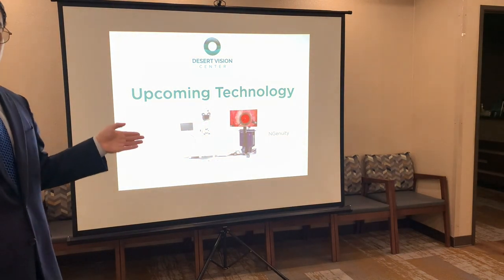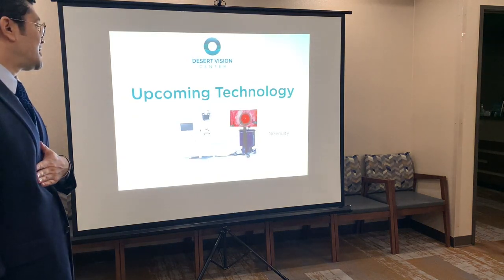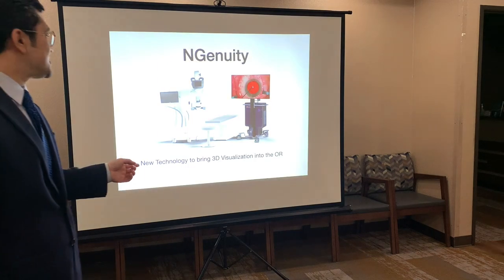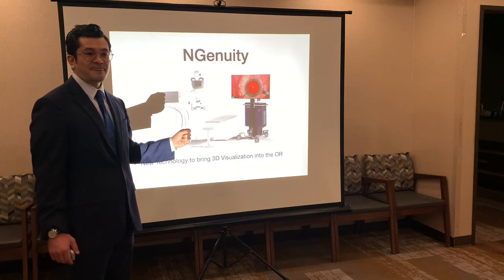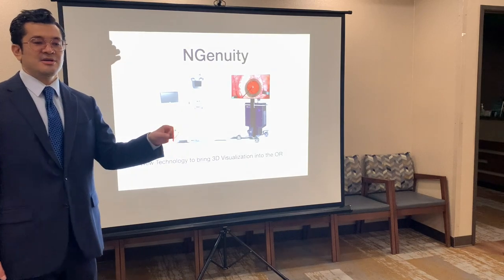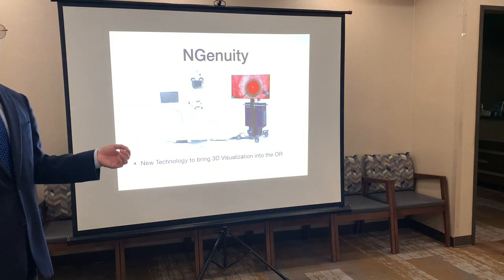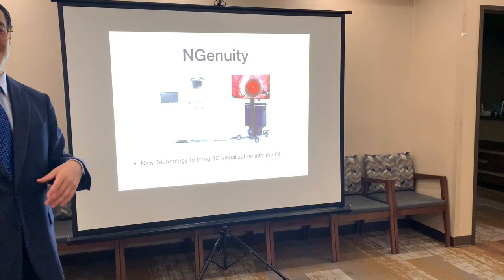Talking about technology, I just want to put this in here because this is something I'm really looking forward to at some point. We have the lens technology, but surgery technology, this is something in the future. Instead of having a normal microscope, we have a digital camera. Instead of looking directly at the eye, we're having a digital processor look at the eye and show us an image on a 3D monitor or 3D TV. So now every nurse in the room can see what we get to see in 3D.